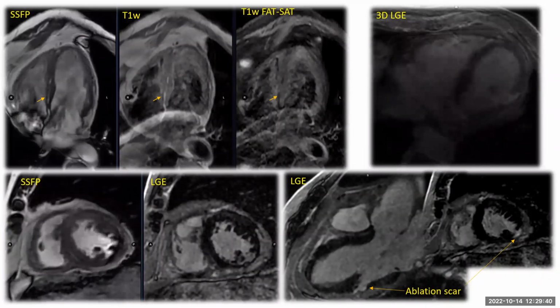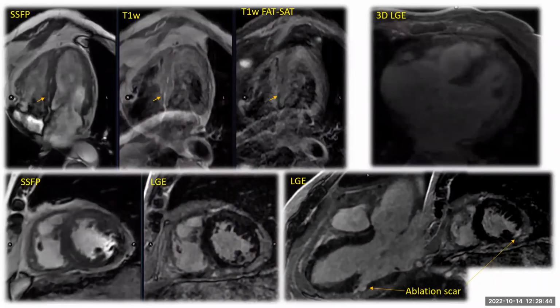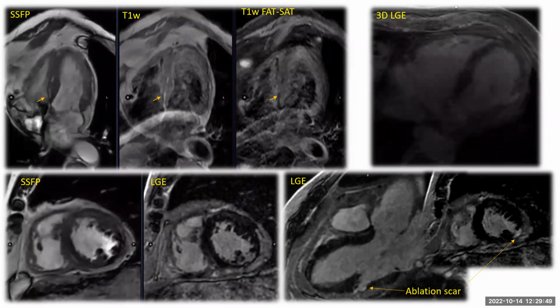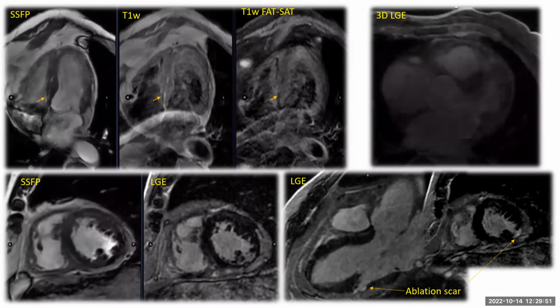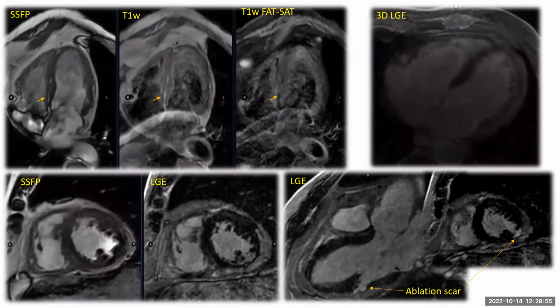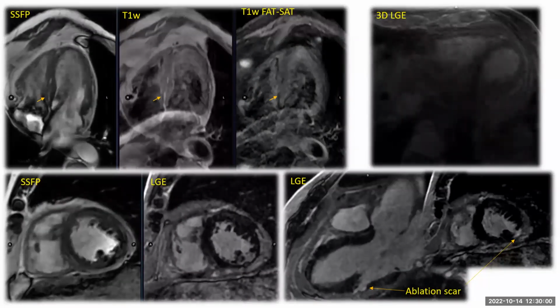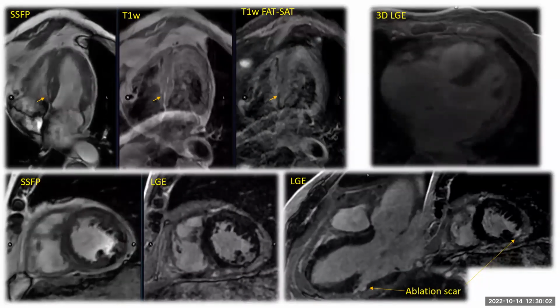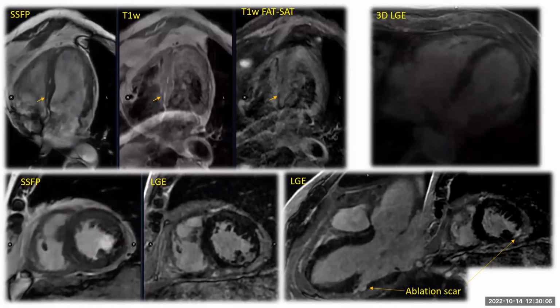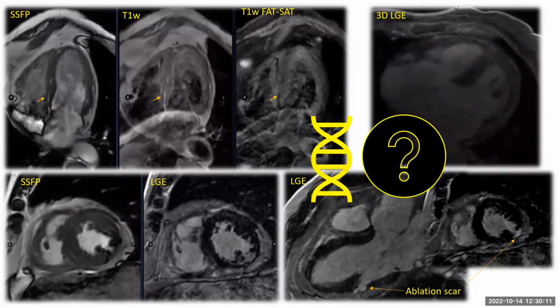In CMR, we can see the confirmation of the intramyocardial fat in the cine, T1 weighting, and T1 weighting with SAT-fat images. There are several multifocal spots with fat infiltration, and there is also subepicardial LGE involving the basal to mid-inferior and inferolateral segments, and focal transmural scar in the area of the papillary muscle related to the previous LV ablation. Unfortunately, in this patient, we are still waiting for the genetic panel.